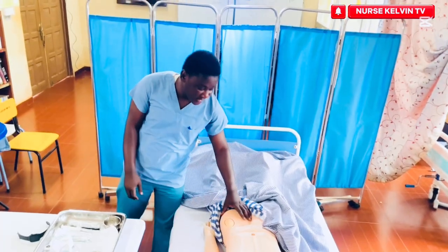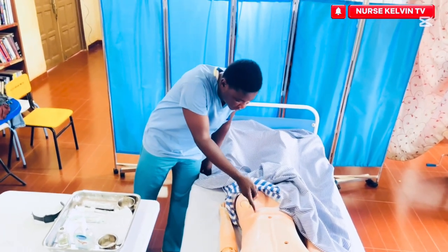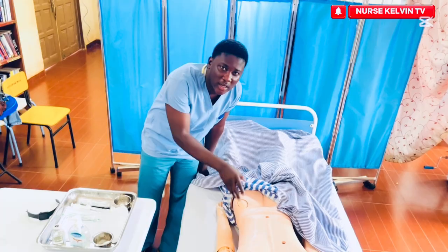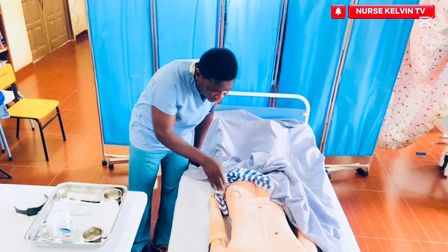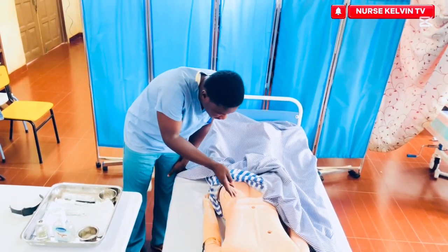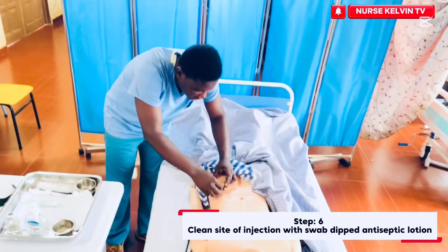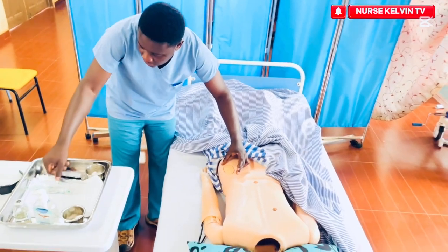You need to divide the gluteal into 4 parts. You divide it like this into 4 parts. Then you are going to inject in the upper outer quadrant. So now I'm doing my division. Here I'm going to inject it. So I need to clean that place with my cotton swab. Afterwards, I'll take my medication.